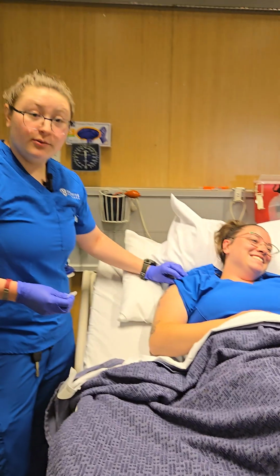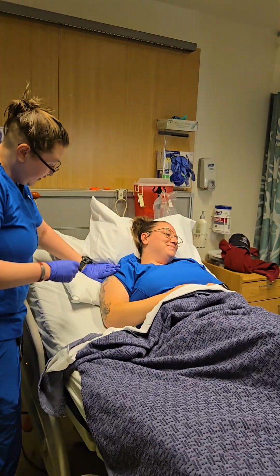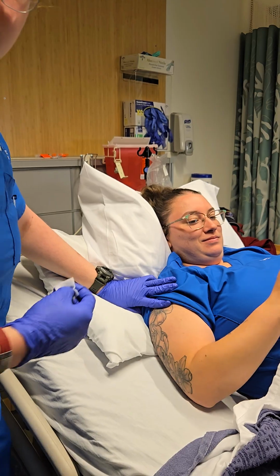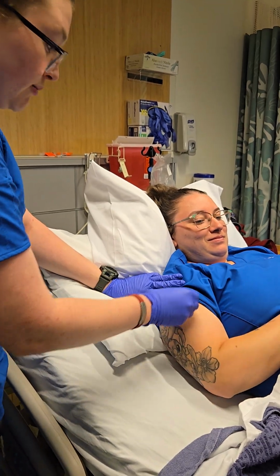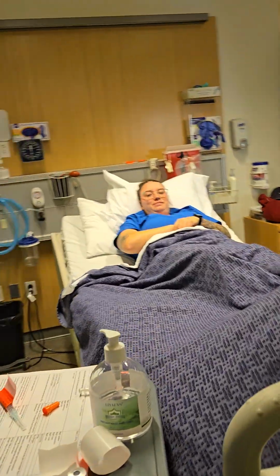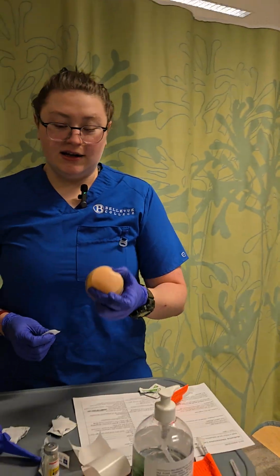So I'd go from the acromion process here to about 3 fingers down, and it'd be right about in here. So can you raise your arm? Yep. So that muscle is activating. I can feel it activating. So I would scrub right here. However, again, because this is a student, we're going over here. We're going to pretend that this is the deltoid.